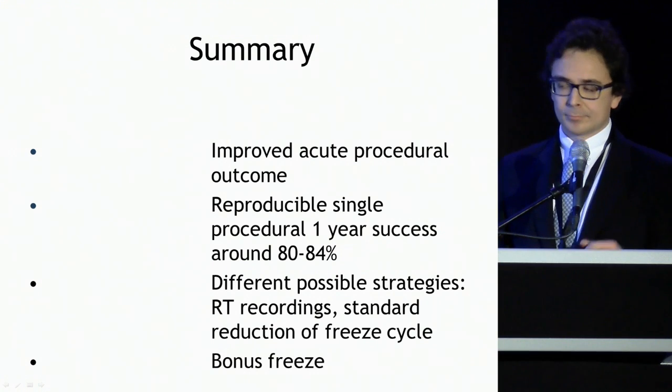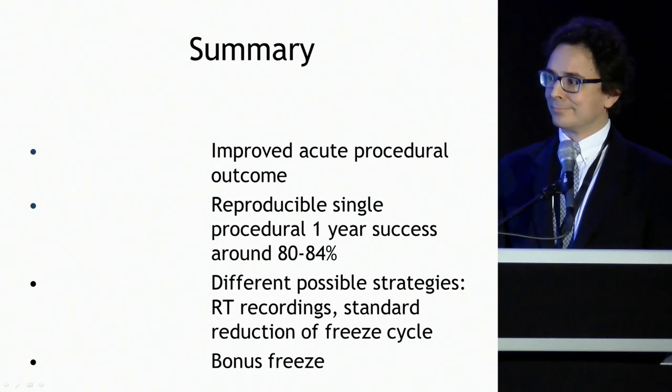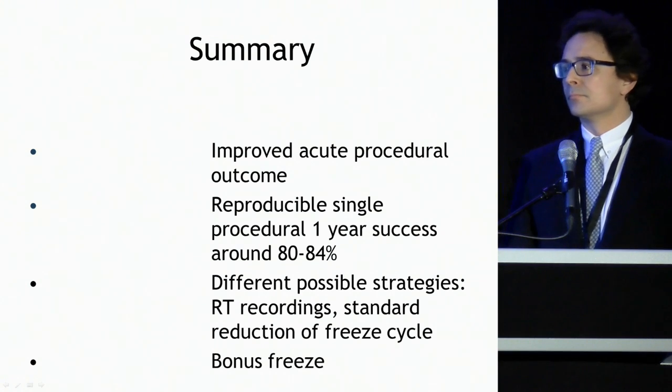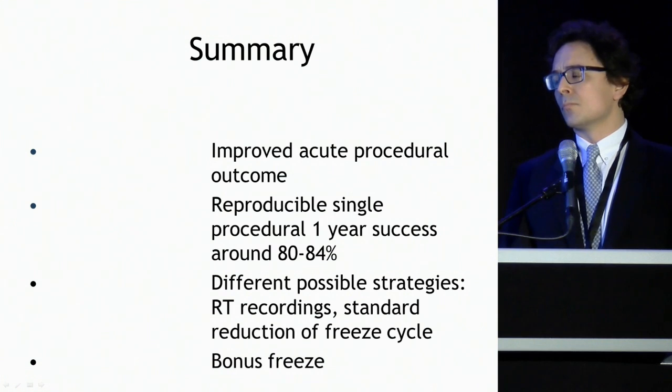Other questions? Harry? Thanks very much. Very nice overview, really illustrative. My question is, do you use temperature measurement in the esophagus? We don't. Okay, but you do use the phrenic nerve stimulation? Absolutely. And what I always find so annoying is that you do this pacing, you see the decrease in the movement, you stop immediately, and still they go into phrenic nerve palsy. How do you explain that?